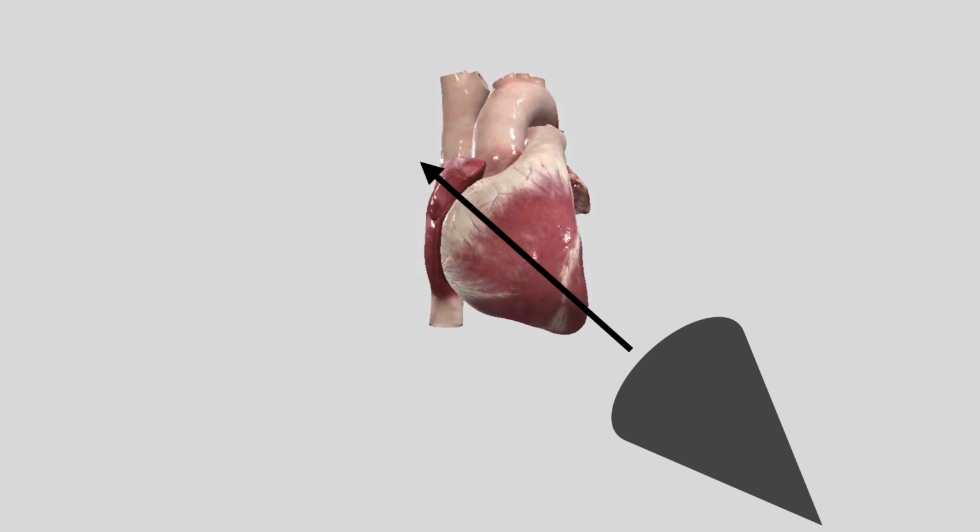In fact, they talk about the point of maximal impulse when you do your exam, right? It's going to be roughly in that space. And so I find, seeing as how most patients with everything from an MI to a stubbed toe get an EKG, that's probably going to happen before I get to my patients, they're going to have a 12 lead. So I find if you go to the patient's bedside and identify that V3, V4 sticker region, right? Pull those stickers off. Somewhere underneath one of those 2 stickers is really going to be the spot that you want to go to when you're doing your ultrasound, right?